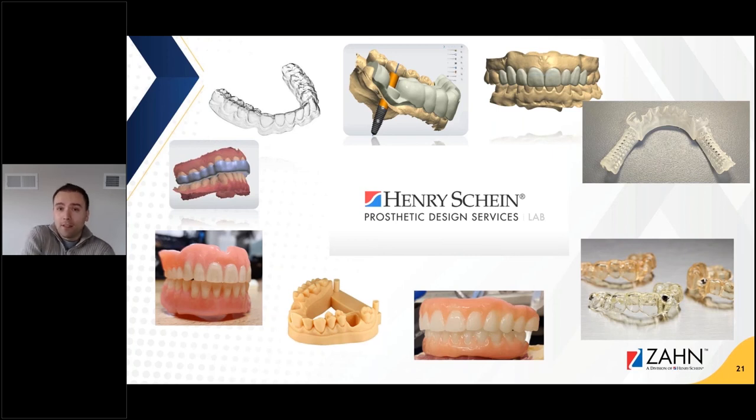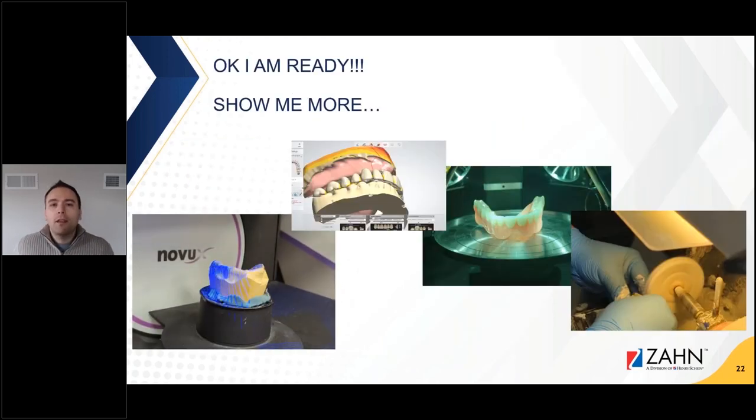If you're a lab that doesn't have those young technicians yet that need to be groomed into doing digital dentures, it is good to find a good milling design center, and even a milling center if you don't have 3D printers in-house, and to rely on those services and really work with them. From what we've tried, these services work really closely with you because they also want to succeed. So they really want to give you what you're looking for, and they can customize your designs just for you with how you like to get your dentures done. So that's pretty cool.